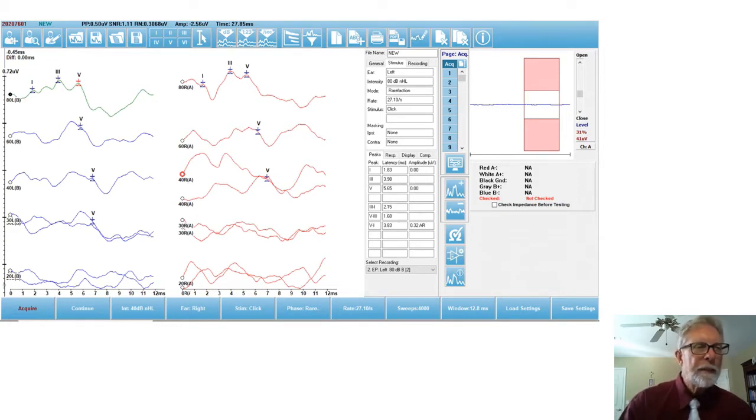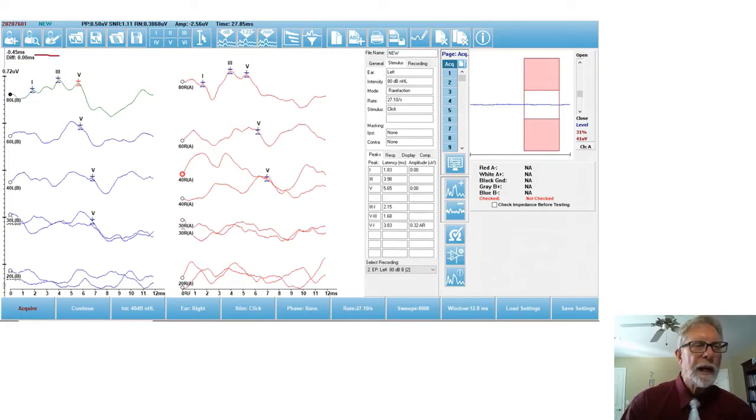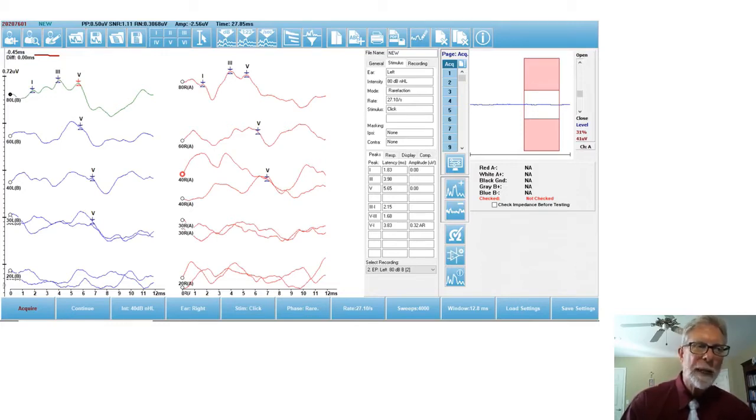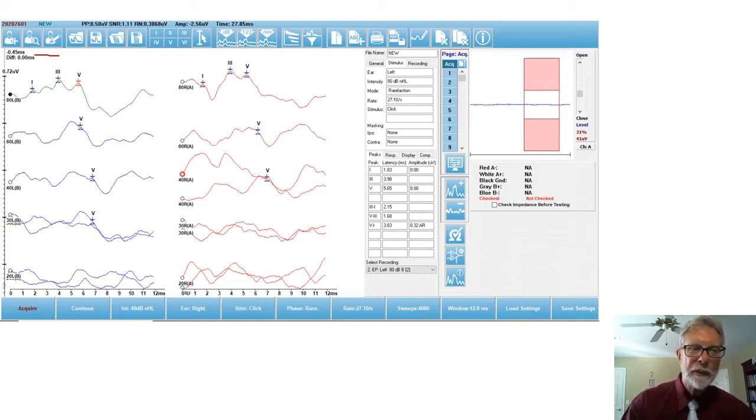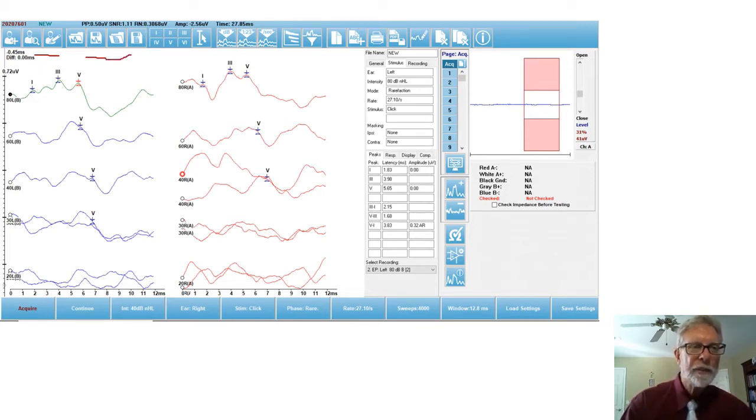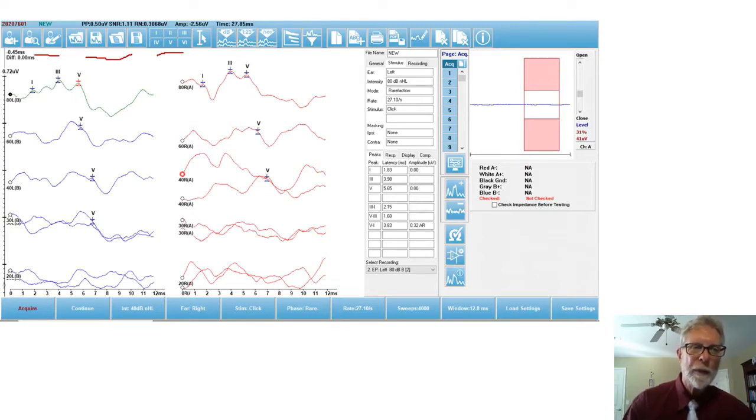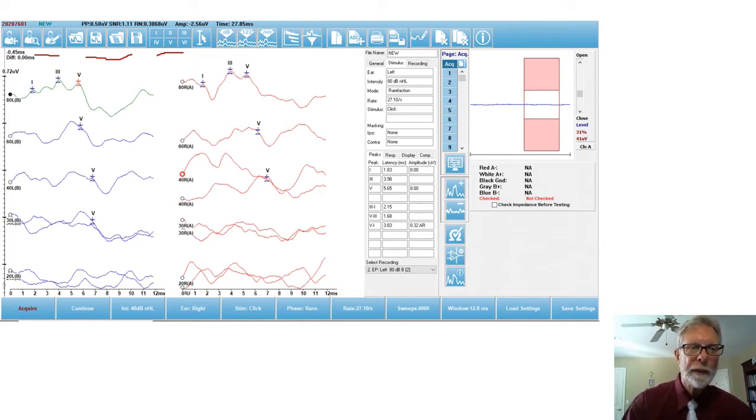Up here these particular icons are what you'd use to enter additional patient information, to look up a patient, to add a new patient, etc. If you're going to save anything to a file, here's how we would do it. We would use these icons in order to choose a marker to label the latencies of waves one through five on the active waveform.